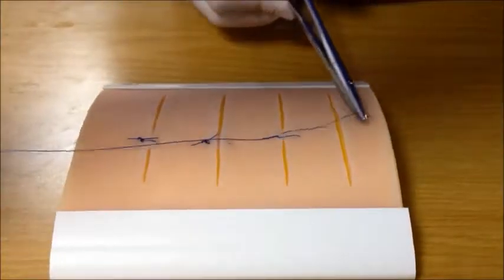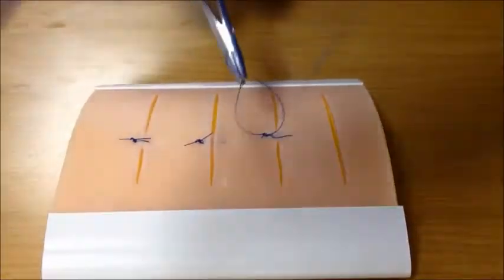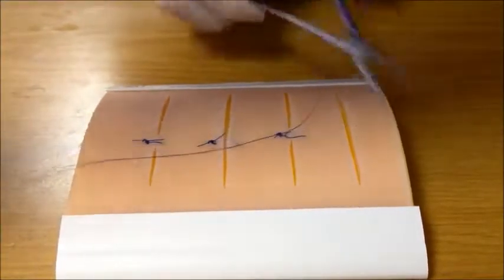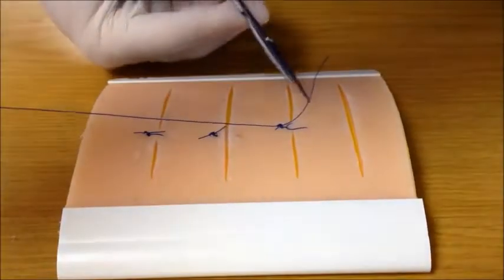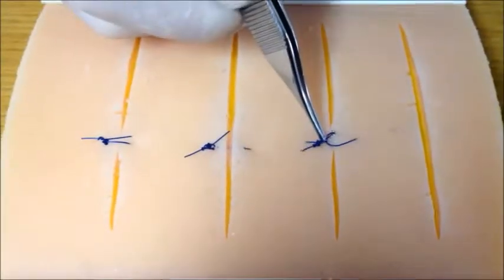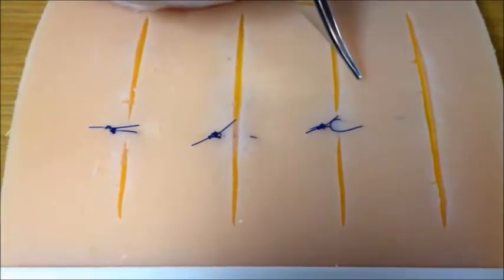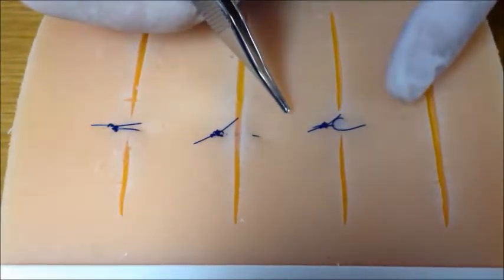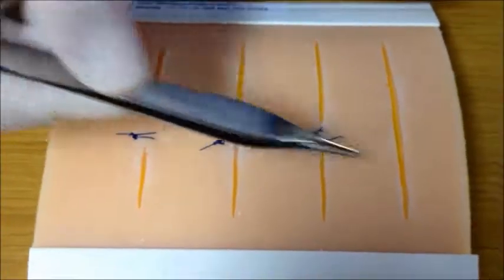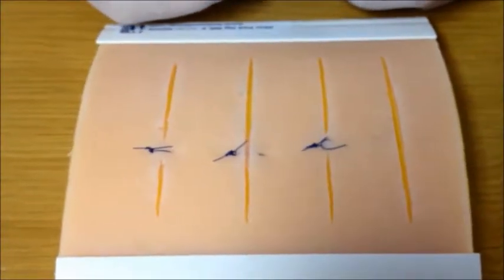Now tie the knot and pull. By passing the needle back through the proximal skin loop, you have created a pulley effect, allowing the physics of this configuration to spread the tension across the wound much more efficiently and close wounds even under a lot of tension much more efficiently. Trim the edges of the suturing material. One potential use for a pulley suture is to do the initial halving or maybe even the second halving and then fill in the rest with simple interrupted sutures in a widely gaping or high tension wound.